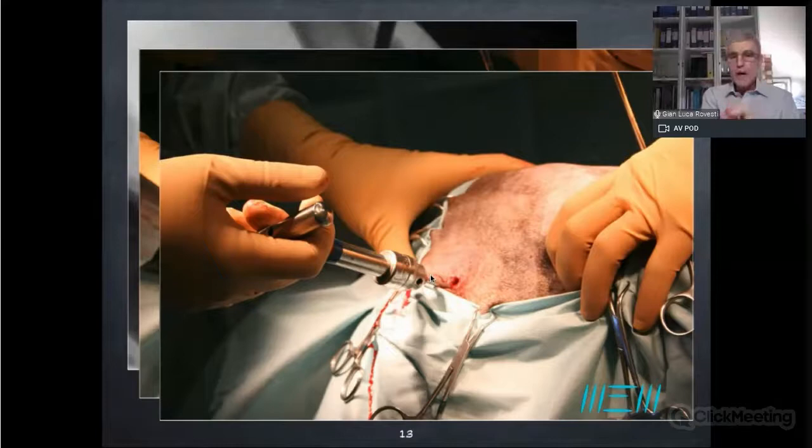This is the principle of muscle ligamentotaxis. What does it mean? Taking advantage of the fact that the bone fragments are not detached from the muscles, I will be able to perform this traction on the femur to pull on all the area, and I will be able to realign the axis of the hemipelvis without opening. This is the interesting part of the story, okay?